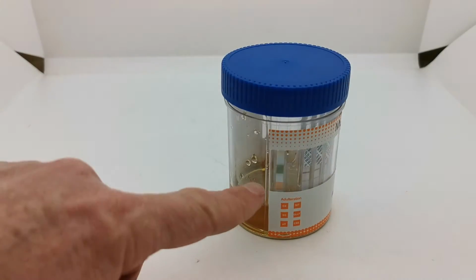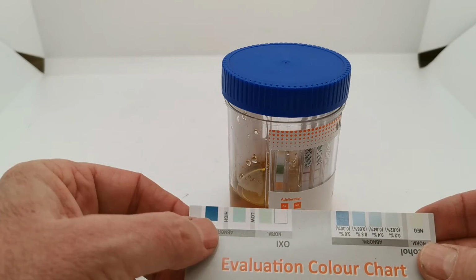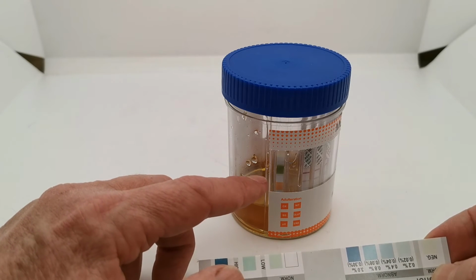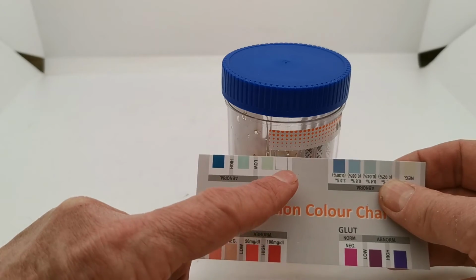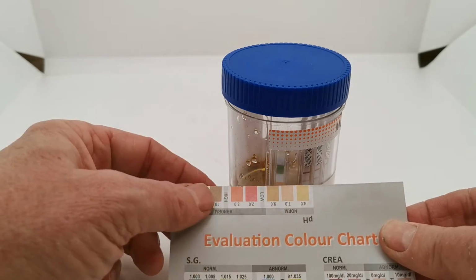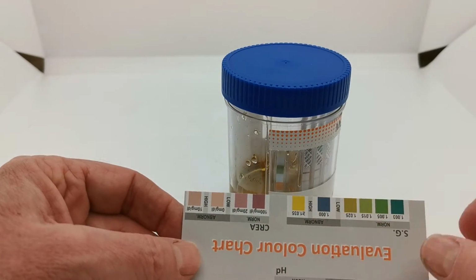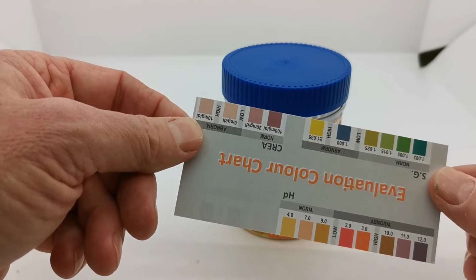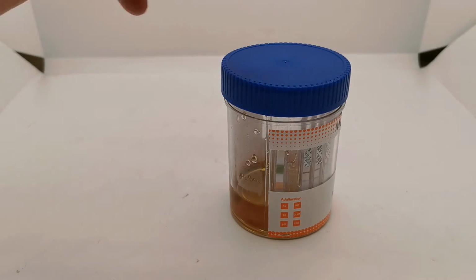Now the next check to perform is at the read time to check the 3 pads against the corresponding pads on the colour evaluation chart that you've got. Now these tests are loaded with a pH test, a specific gravity test and an oxidants test. So find the corresponding panel on your card and you're looking for a match within the normal range. If I check the pH, yes, that's normal, and the specific gravity, yes, again normal. If you find any of the colour pads on the adulteration test match an abnormal area, that is suspicious that the sample that has been added may have been contaminated or is not normal strength, normal pH human urine. So the adulteration test complete.